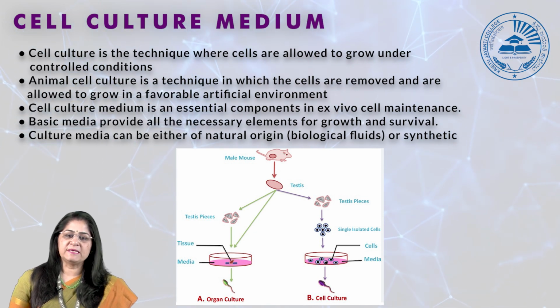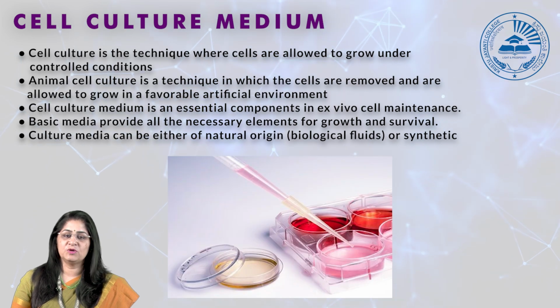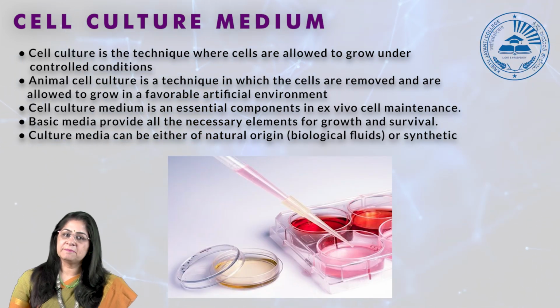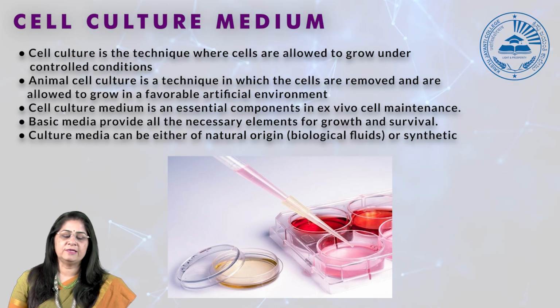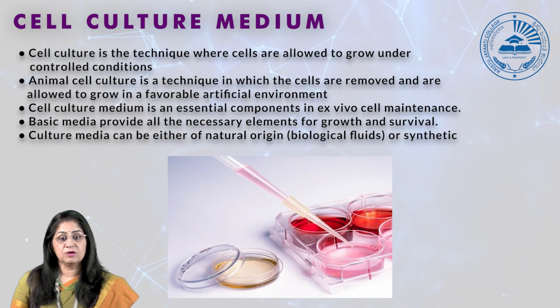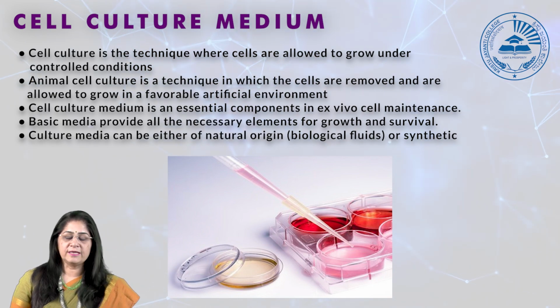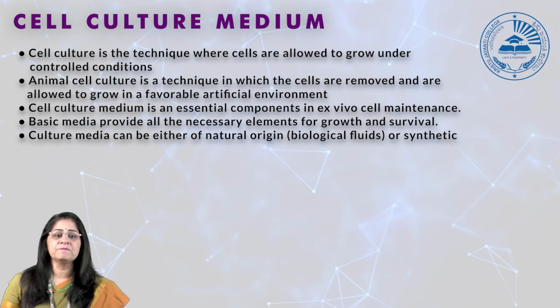Cell culture medium is an essential component in ex vivo cell maintenance because that is like giving life to our cells. Basic media provide all the necessary elements for growth and survival. So culture media can be either of natural origin, which are biological fluids, or synthetic. We are going to discuss the different cell culture media.